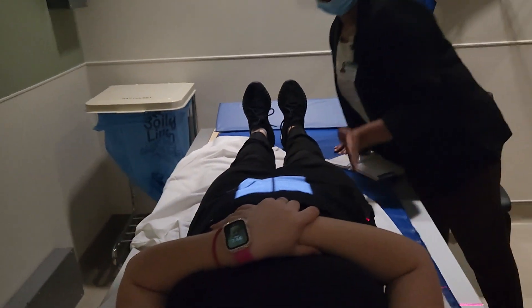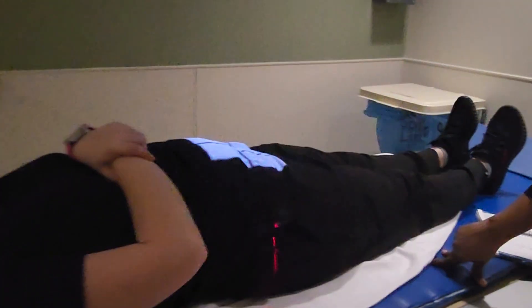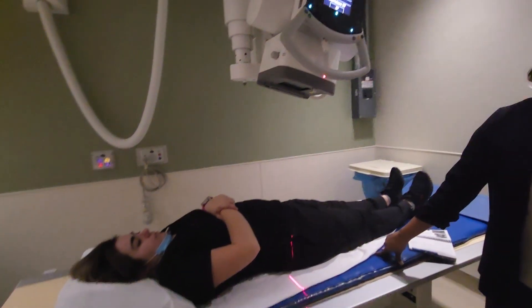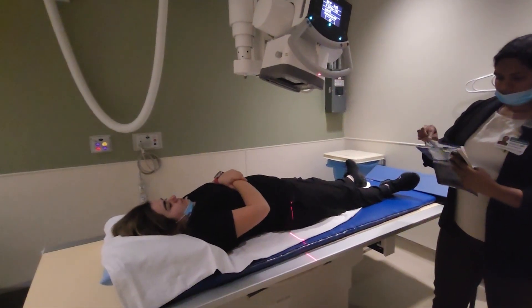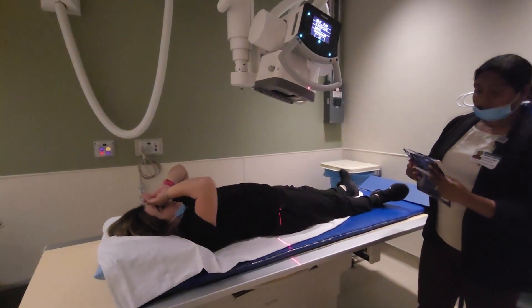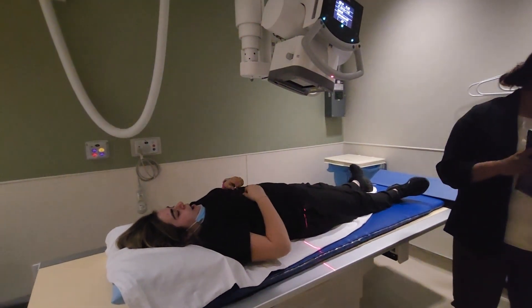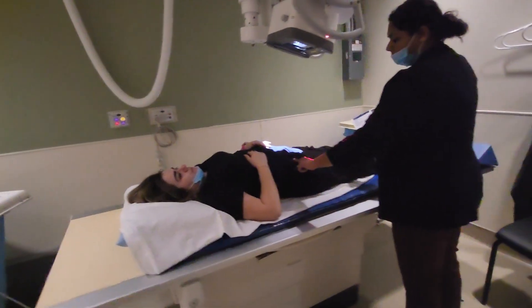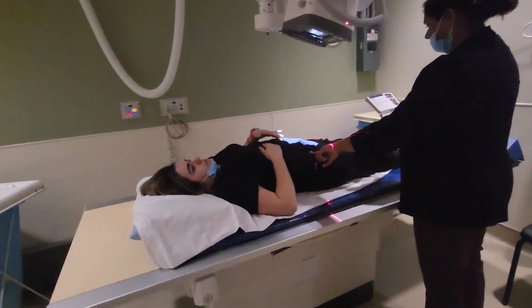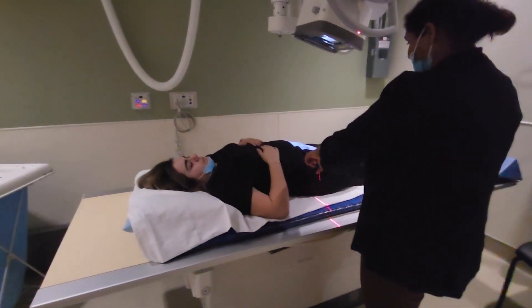For AP lumbar, you center at the iliac crest. For AP SI joints, you're at one and a half inches above the pubic symphysis. For the sacrum, it's two inches below the ASIS — which is at the level of the pubic symphysis. Two inches below the ASIS, not the pubic symphysis — right now it's at the level of the belly button. For sacrum it should be two inches below the ASIS, which is right at the pubic symphysis.